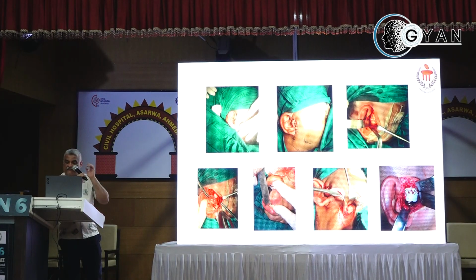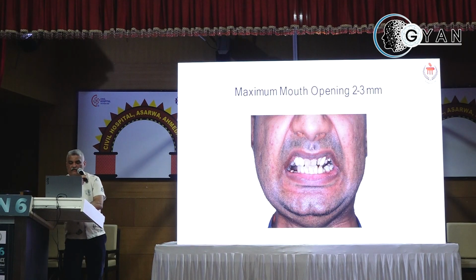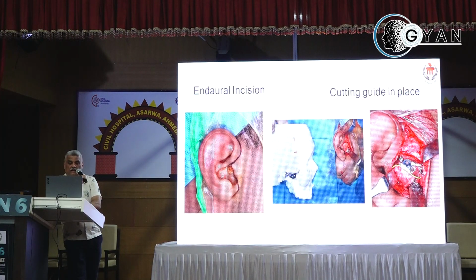Those days, this was my first case that I did. A high submandibular or a periangular approach doesn't matter in these kinds of cases. All you want to know is that the joint is sitting well, and that's his post-op. And these are many other kinds of cases where you do your TJRs, where there is bilateral TMJ ankylosis, and this patient came to us with severe ankylosis, with part of the bony cranial flap removed there.